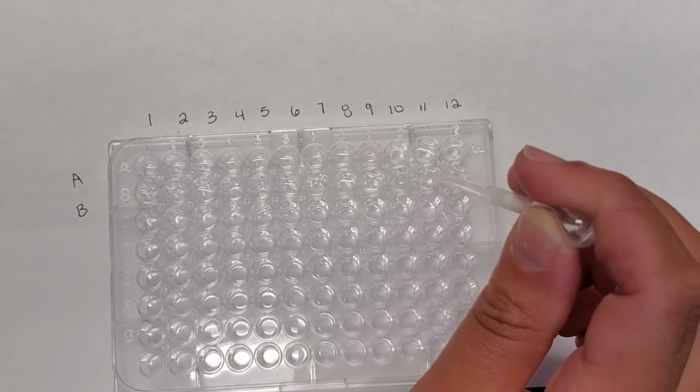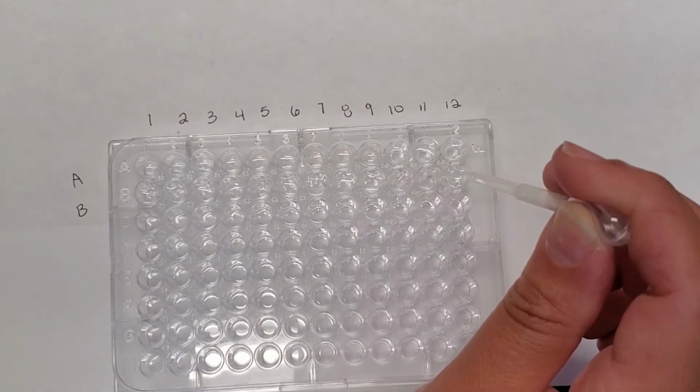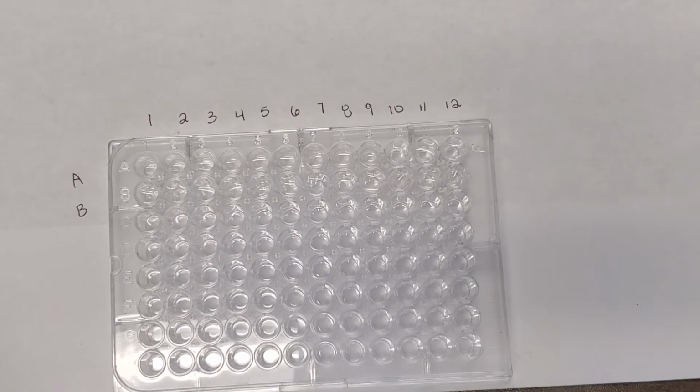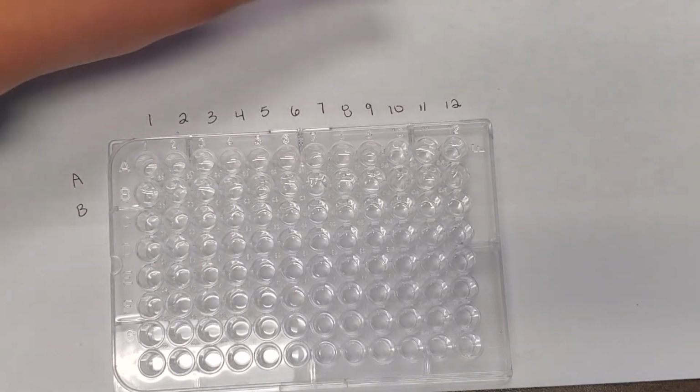So again, we're testing each patient 3 times, and the reason we're testing them 3 times is just to make sure that our results are accurate, because remember, the ELISA can be used as a first diagnosis for HIV, so you want to definitely make sure that your patient is positive and you're not giving them a false result.